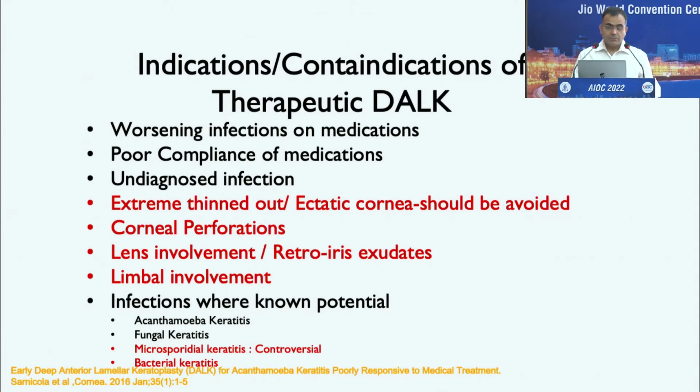I'm going to discuss the role of DALK, or deep anterior lamellar keratoplasty, for infectious keratitis. To begin with, what are the indications and contraindications of doing therapeutic DALK? Indications are worsening infections, as in any other surgical management of infection on medications, or poor compliance with medications in a patient with worsening infection, or undiagnosed cases of infection.